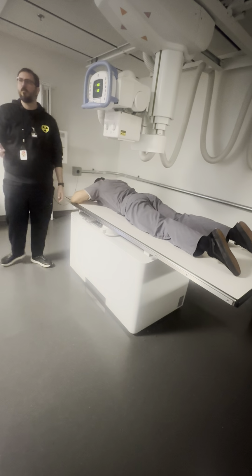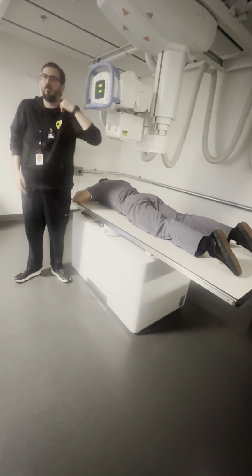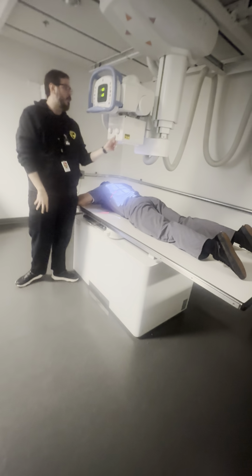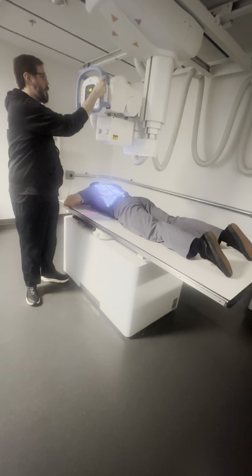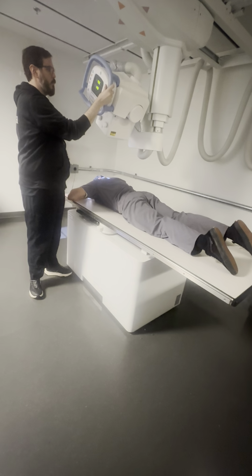There's an axial for the barium enema, and it goes the opposite direction. You go caudad because you're looking through the sigmoid and rectum. So you flip them back and forth, right? Now 35 to 45. For my sthenic patient, which one do you think I'm going to do? 45. Why would it be 45?